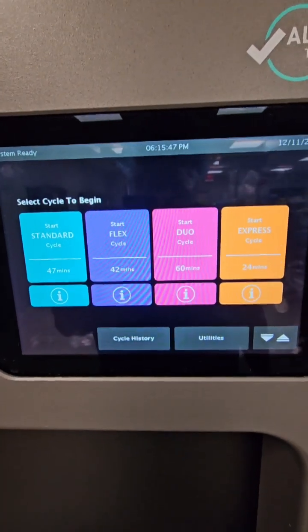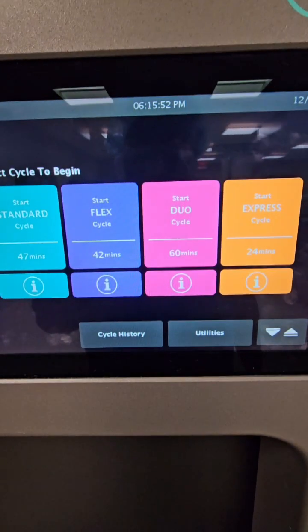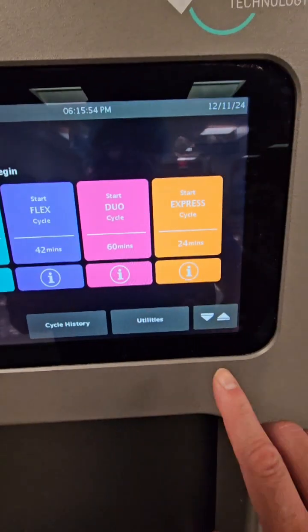Let's look at this screen. We have four cycles to choose from: Standard, Flex, Duo, and Express, and a fifth one to come that I'm very excited about.